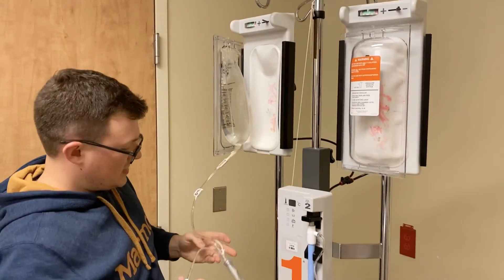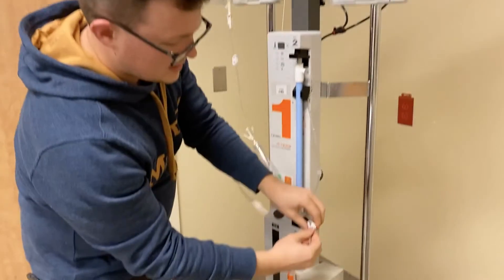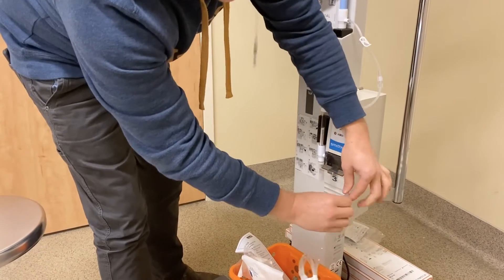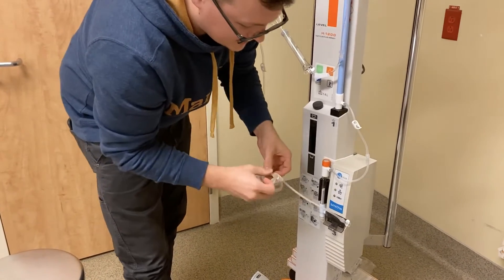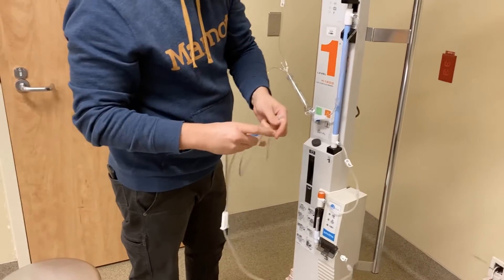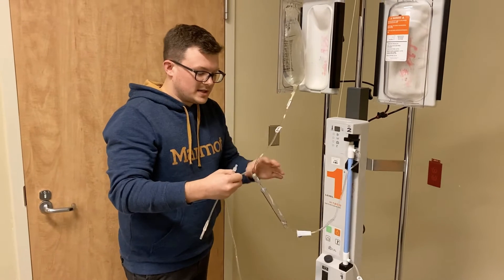Then go through and make sure all your connections are secure and clamp everything. Clamp here, make sure that connection is secure, clamp this, make sure that connection is tight, clamp that — there's a connection there you need to make sure is correct. Then take this off and roller clamp that.